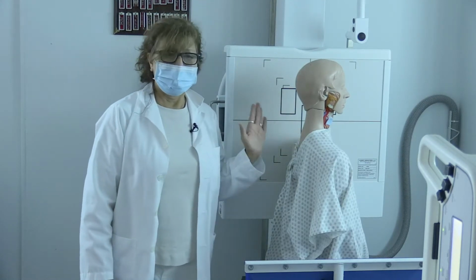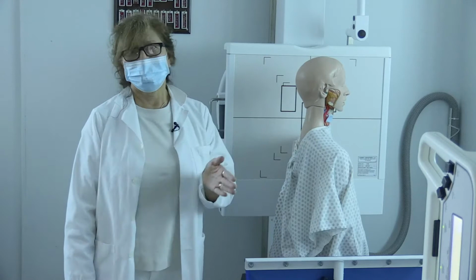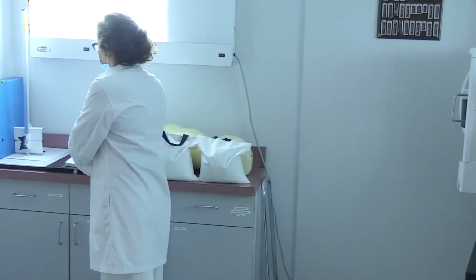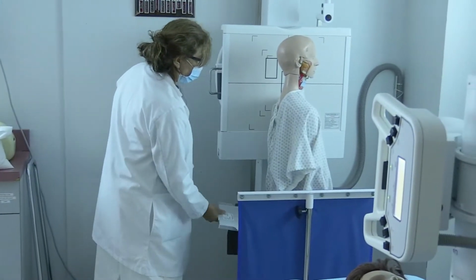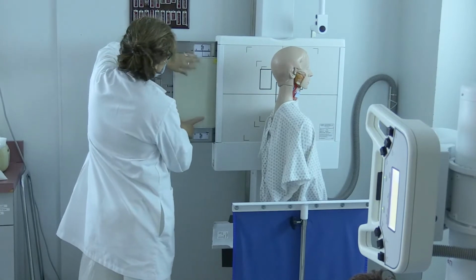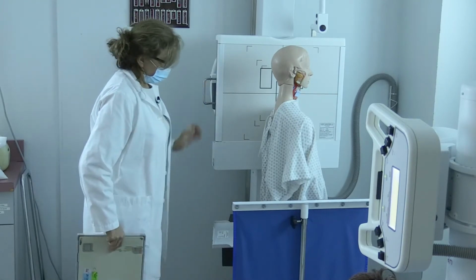If a patient is a trauma patient and they're not able to sit up or stand, you can do a cross-table lateral C spine, and you can do this with or without a grid. I'm going to use a grid. I like grids. So make sure you have a good technique for both. Some patients, if they're small and their shoulders are narrow, are not necessarily going to need a grid.